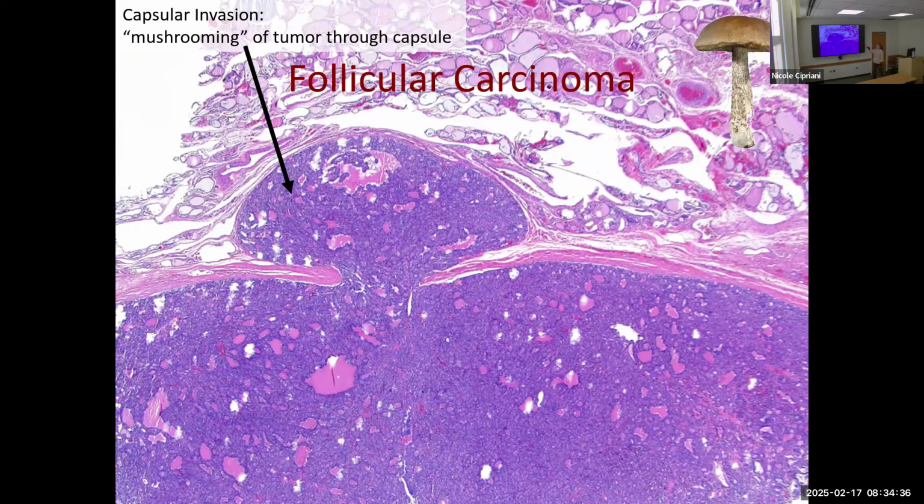What happens if you have a follicular adenoma that has an invasion? Of course, then it's follicular carcinoma. So the amount of times you're going to see the classic capsular mushroom-shaped invasion that they talk about in the textbooks is probably very rare, and usually you may find satellite nodules out here without the nice stalk, but that's related to the plane of sectioning, right? And so if you catch the stalk, great. If you don't catch the stalk, you still have to be mindful that these things outside the capsule could be follicular carcinoma, foci outside the capsule.